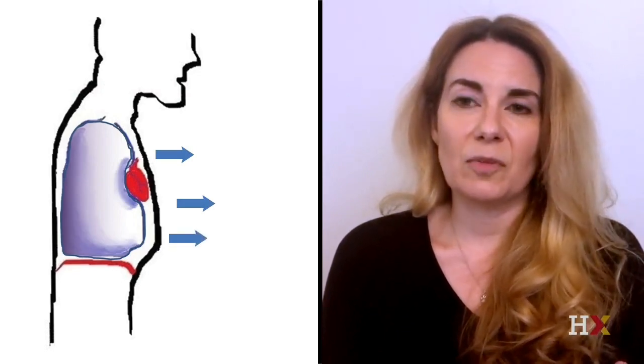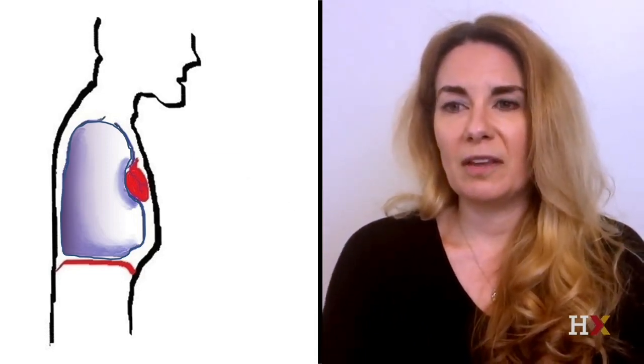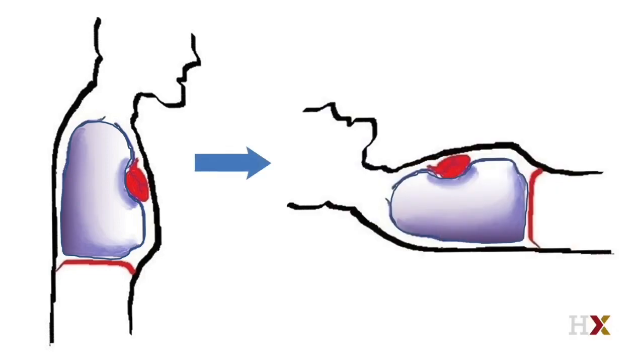When these patients present, they're often sitting upright, using significant negative inspiratory force to maintain their recruitment and optimize their VQ matching. When we determine that the patient needs to be intubated, we provide sedation, we provide neuromuscular blockade, we lie the patients flat, and they de-recruit. So the heavy, boggy lungs will collapse upon themselves, causing de-recruitment and causing profound hypoxemia.